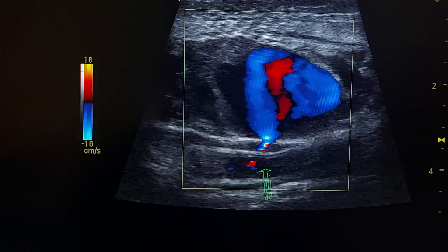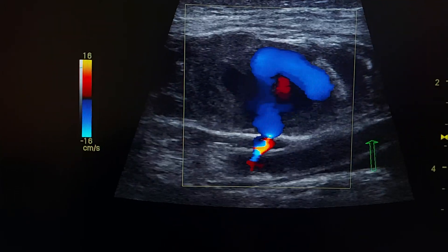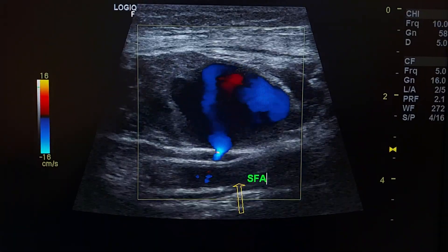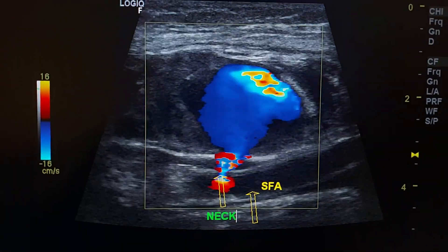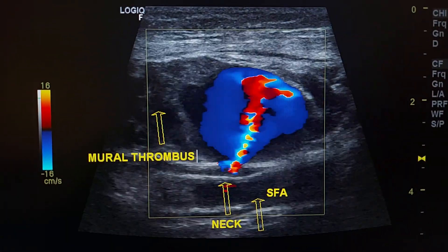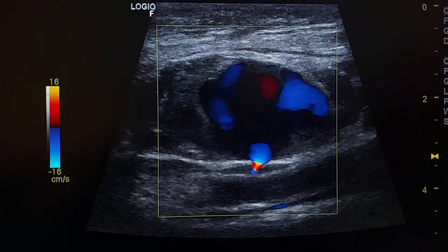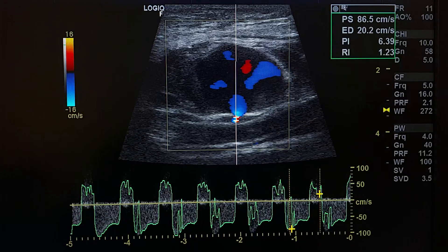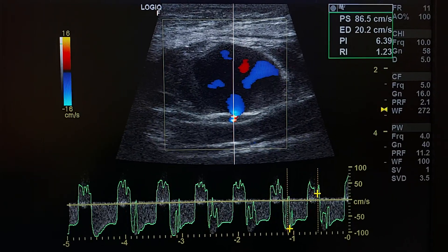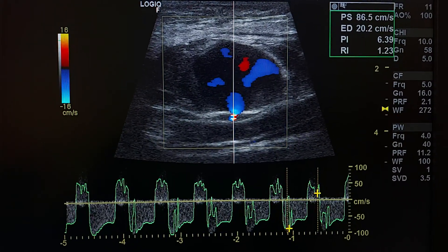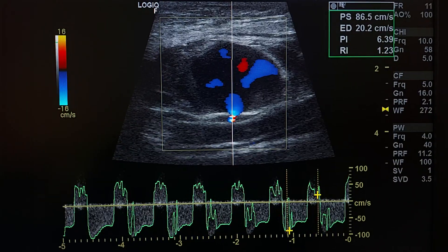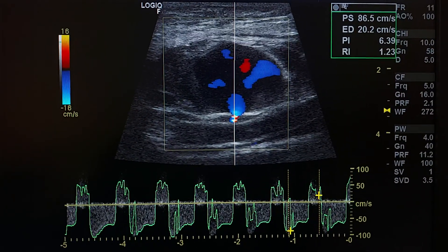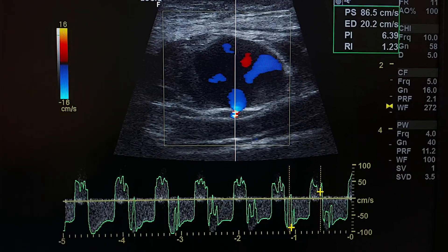This is the superficial femoral artery. This is the spectral Doppler of the neck of the pseudoaneurysm. We see to-and-fro movement of blood in the neck of the arterial aneurysm.